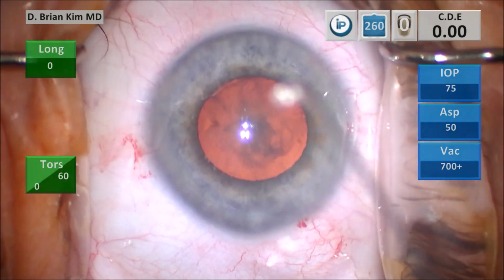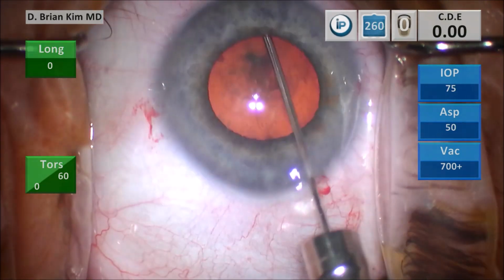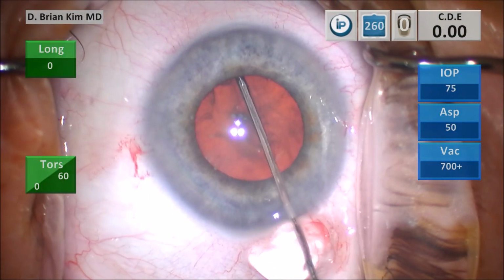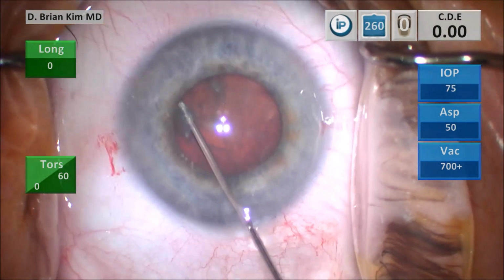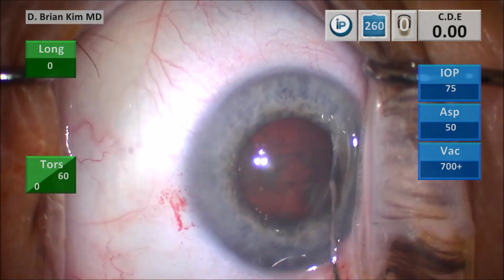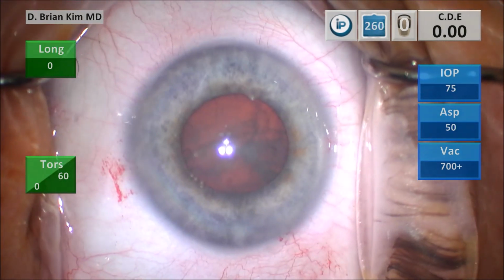I'm going to do my capsular fornix hydrodissection technique. Place the cannula out to the contralateral equator underneath the anterior capsule rim into the fornix. Point the tip down, get a nice fluid wave, decompress on the left side, and then spin with the right side with the tip downward. You get a nice rotation of the lens.